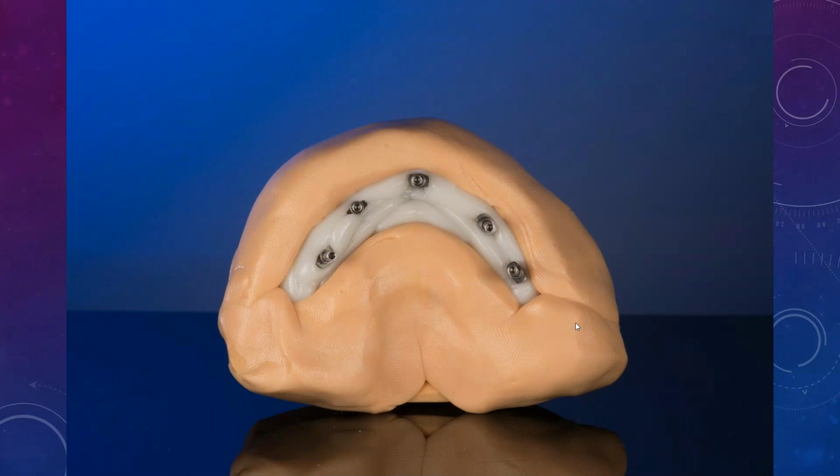Okay. And this is how I usually make verification jigs out of stone. Why do I use stone, either metal or stone? Because stone doesn't flex. Especially if you're doing a zirconia hybrid, and you're going to do a verification jig that's, let's say, pattern resin, and maybe you didn't make it thick enough, and you had some flexibility, so it's no longer passive. You make a zirconia from that same verification, and you go to torque it down in the mouth, that little discrepancy will snap it right there and then. So you want to be careful doing that.